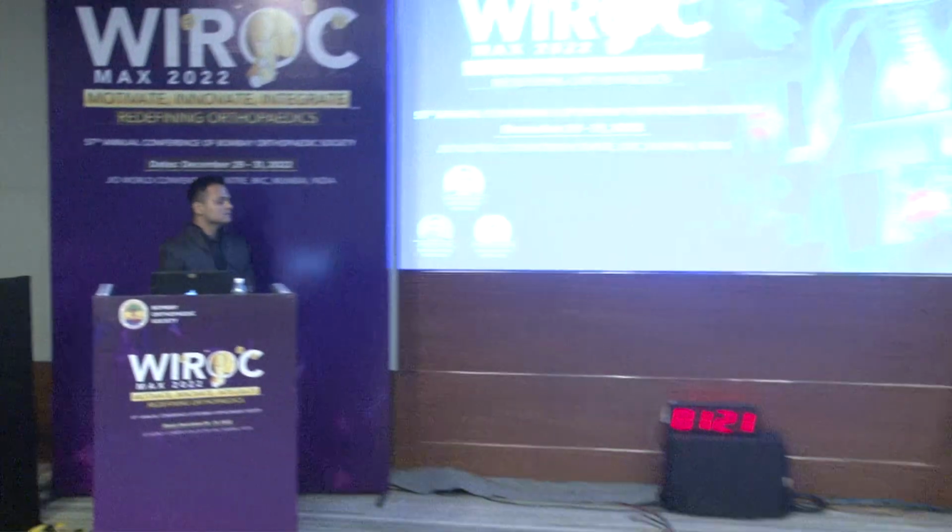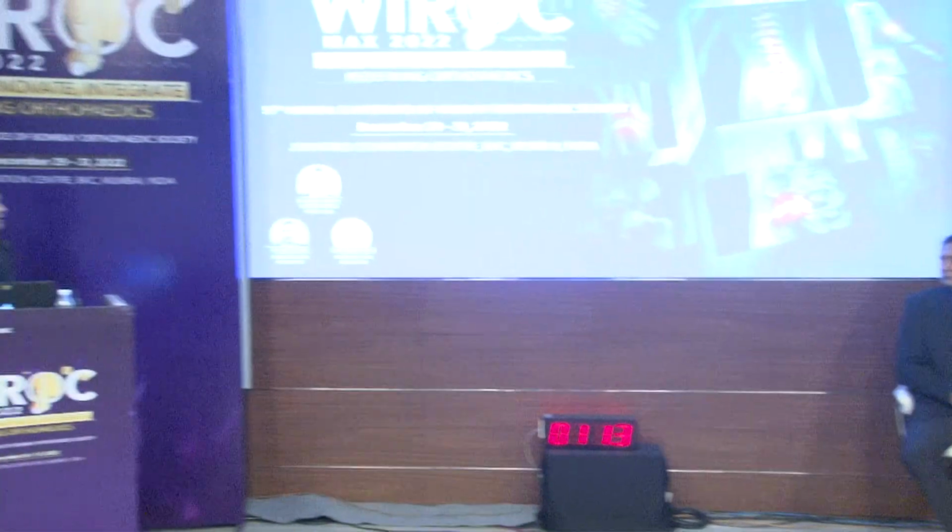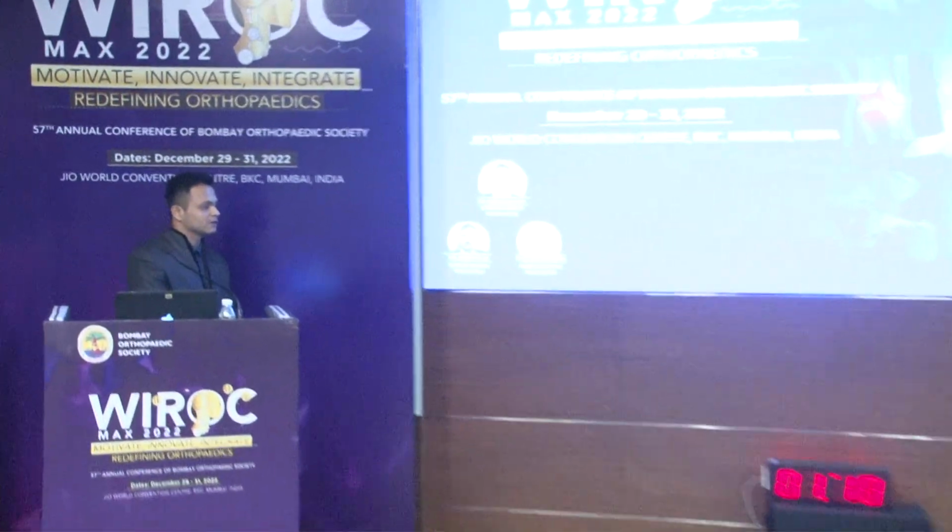What about comminuted fractures? You mentioned it showed only the transverse fracture. 3-4C includes transverse as well as comminuted. Sir, yes, for comminuted also you would recommend this. Yes, so that round cerclage is for containment of all the comminuted fragments.